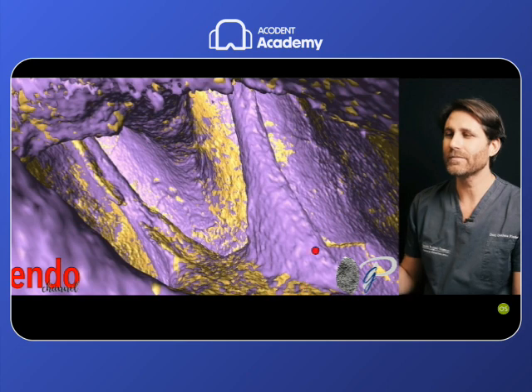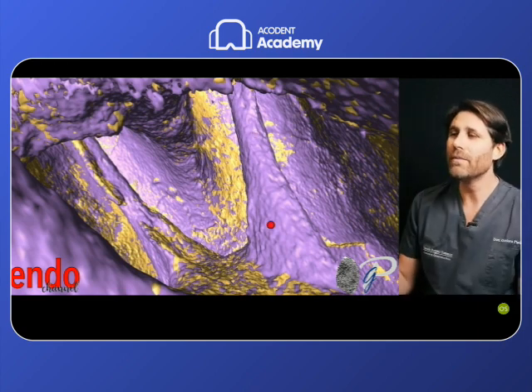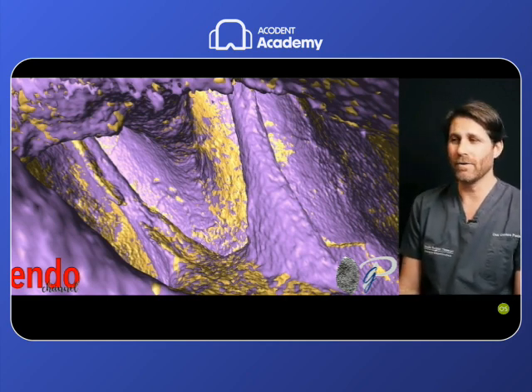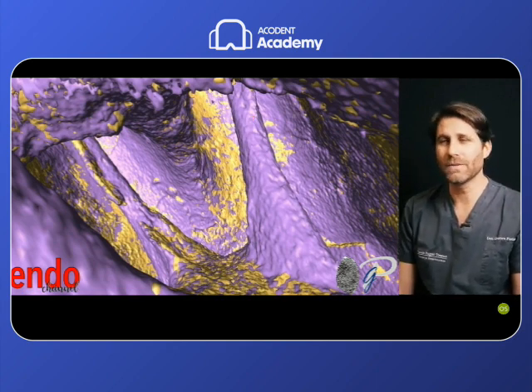And here you can have a look at the amount of dentin that we have to remove at the end of the preparation of this root canal, to permit a safe, effective, and predictable preparation of this MB2 root canal up to the terminus. So we can remove this amount of dentin, this triangle of dentin, with different strategies.